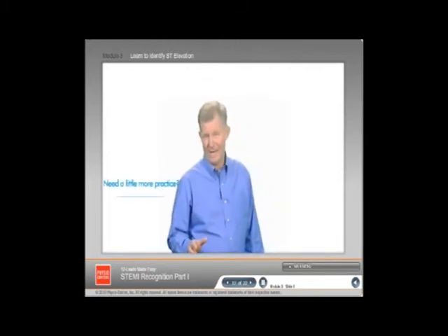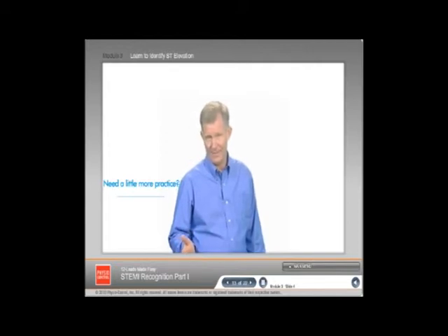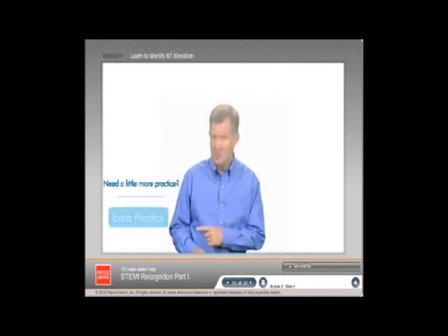If you would like additional practice at identifying ST segment elevation, just click here.